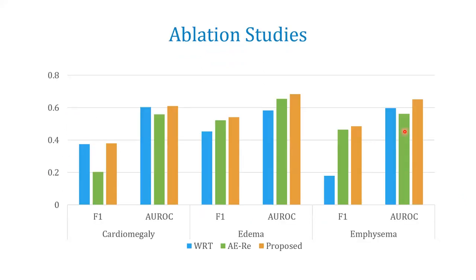We have also performed a number of ablation studies to look into the impact of retraining and to look into the impact of cluster-based losses in the autoencoder. So this WRT is the experiments without retraining, and this AERE is the experiments without using the cluster-based loss in the autoencoder. So this AERE is the autoencoder with only the reconstruction loss.